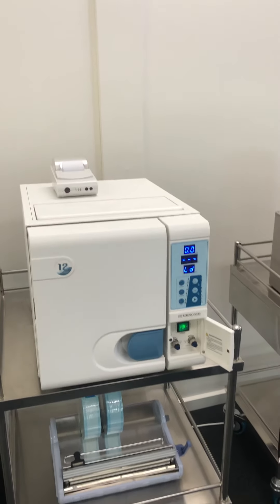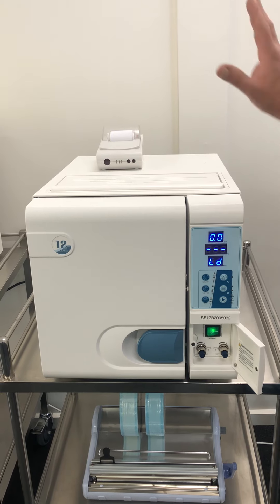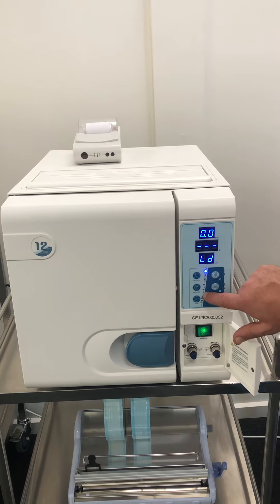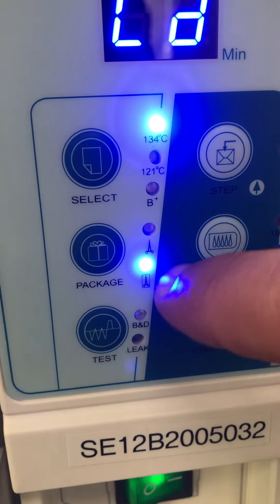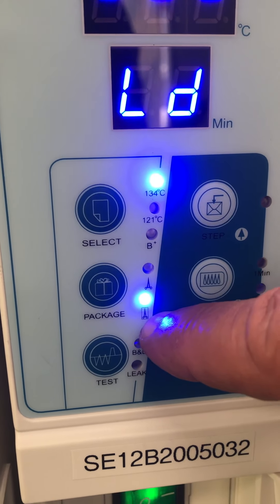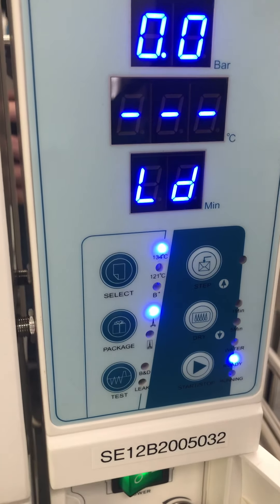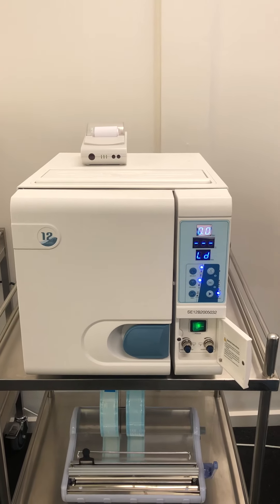Your main cycles for this machine: once you've got your instruments in there and your distilled water in, the cycle you'll be doing most is 134 degrees — that's the top button. If you're using sterilisation pouches, press that button twice so you've got the little blue light on for an instrument covered in a pouch. If you're going to use the goods straight away without pouches, use the top one and use the instruments within two hours, otherwise they won't be sterilised anymore.